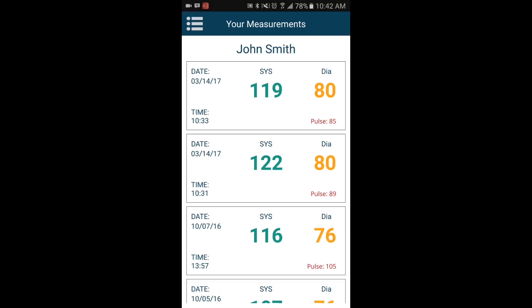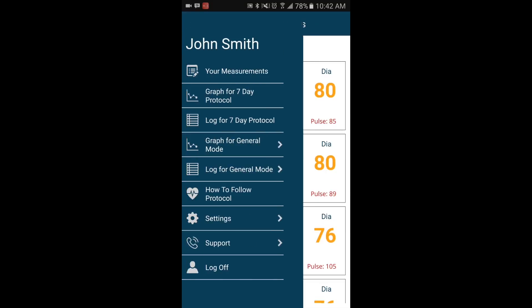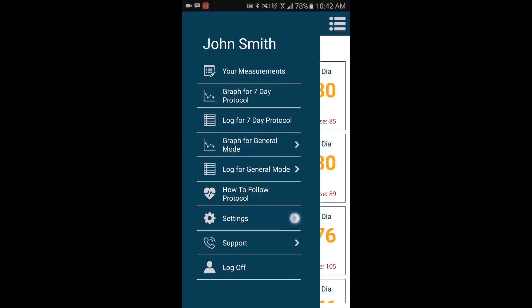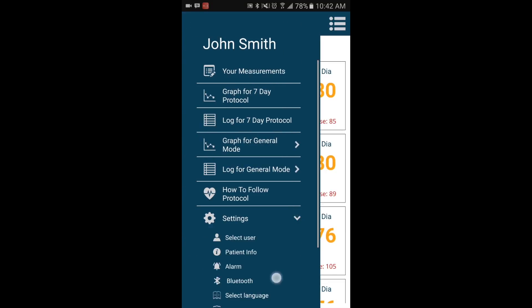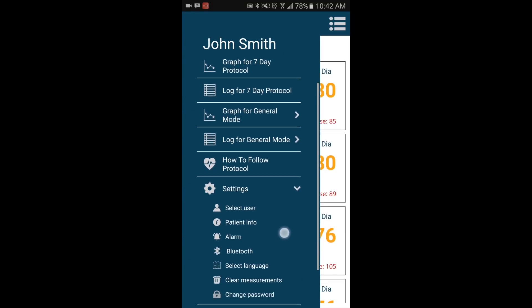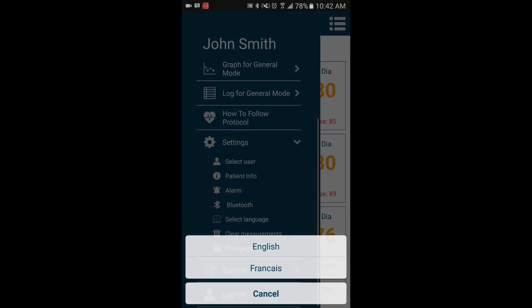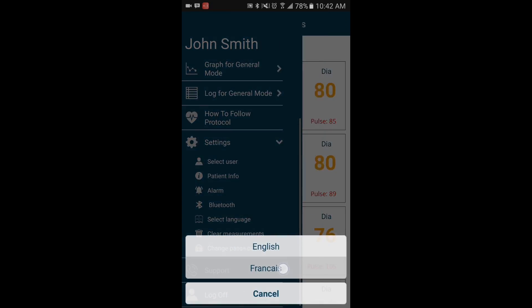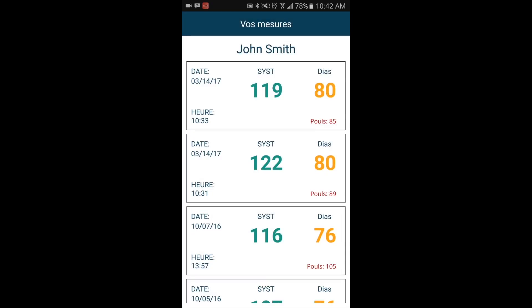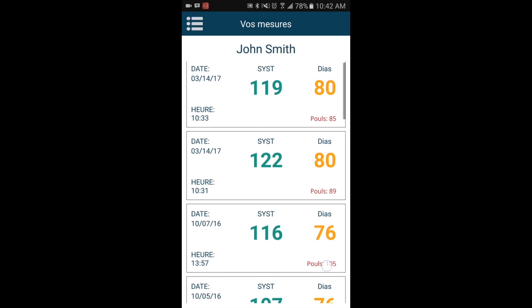You can choose to view the app in English or French. To change the language, go into Settings and choose Select Language. You can now choose your desired language.